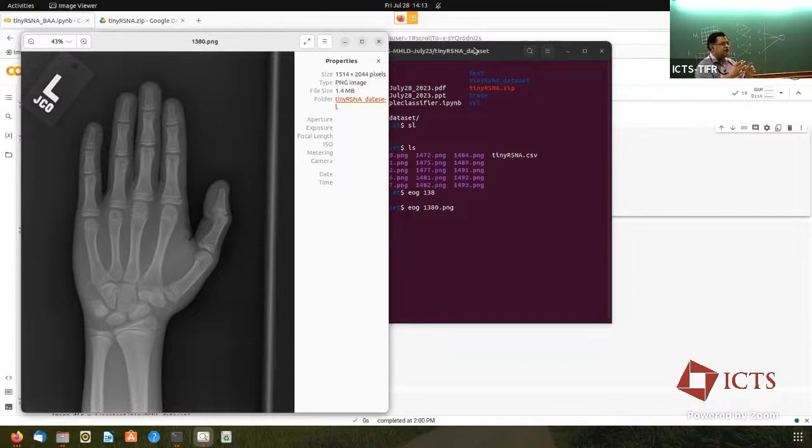That output can then be passed into functions like ReLU or something. So those outputs can be massaged in particular ways. I don't want to get into the architecture very much, but essentially there's a couple of convolutional layers, then some normalizations, a couple of convolution layers, some normalizations, and so on and so on. You can read up about all this.